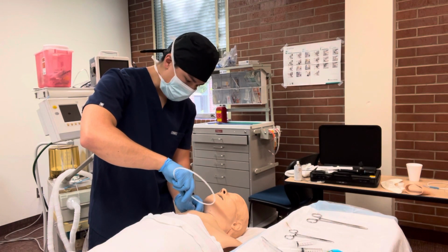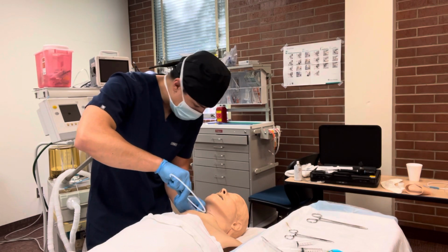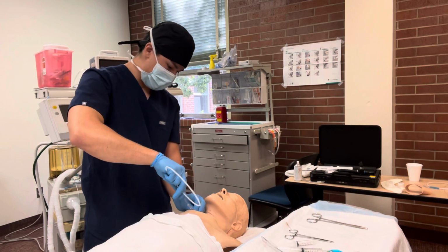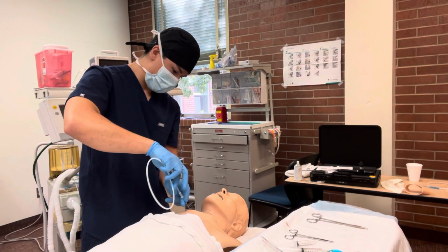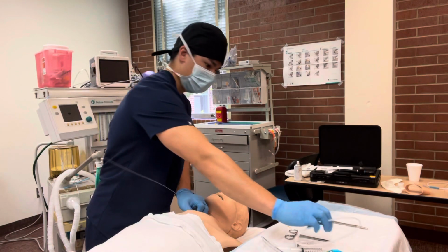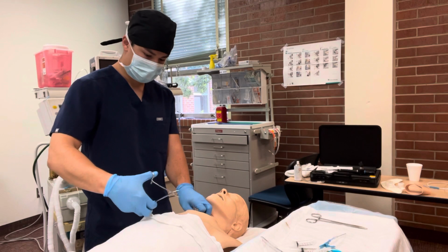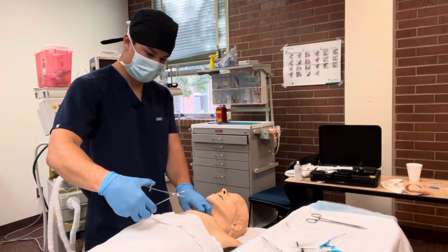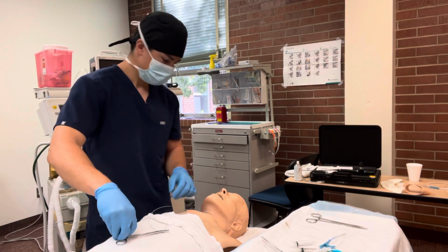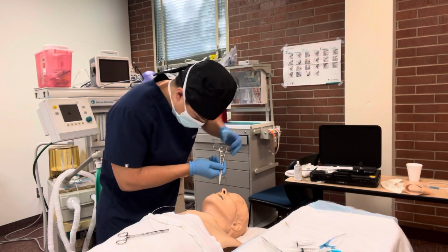I'm going to insert my guide wire all the way until I see it in the back of the throat. And then I can remove my needle. I'm going to clamp the distal ends. Use my Magill's or hemostat to grab it out of the mouth.